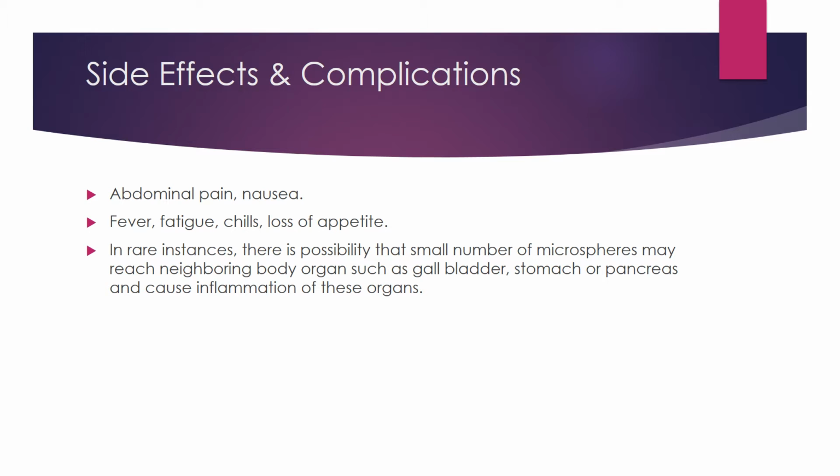Side effects and complications include abdominal pain, nausea, fever, fatigue, chills, and loss of appetite. In rare instances, there is a possibility that a small number of microspheres may reach neighboring body organs such as the gallbladder, stomach, or pancreas and cause inflammation of these organs, like cholecystitis, gastritis, or pancreatitis.